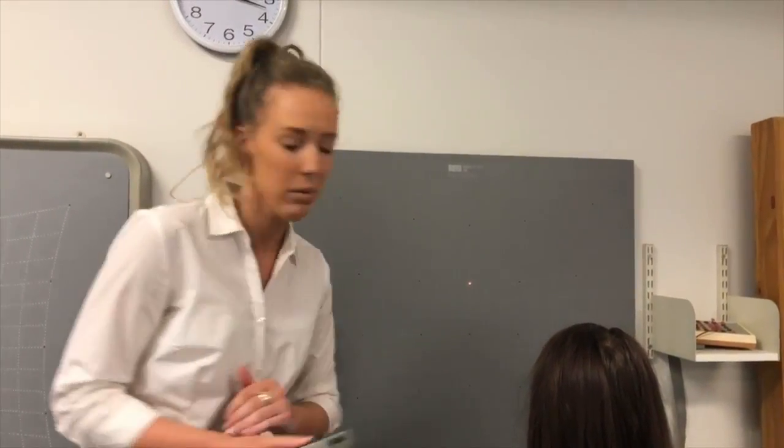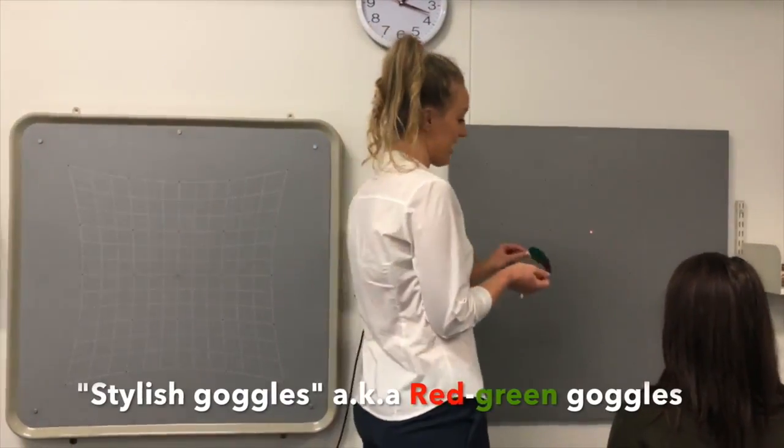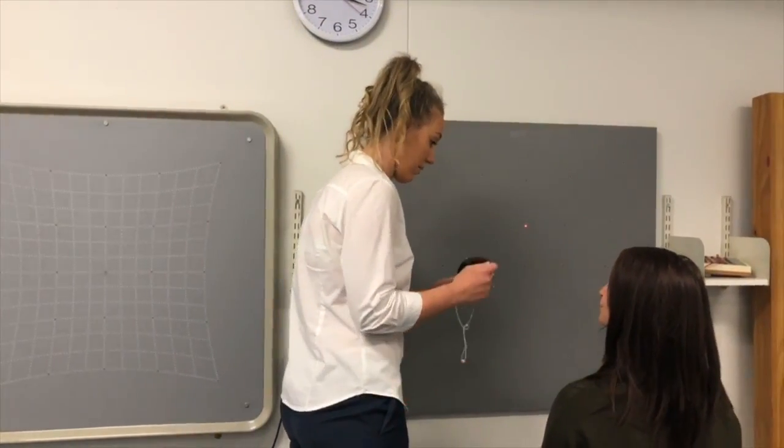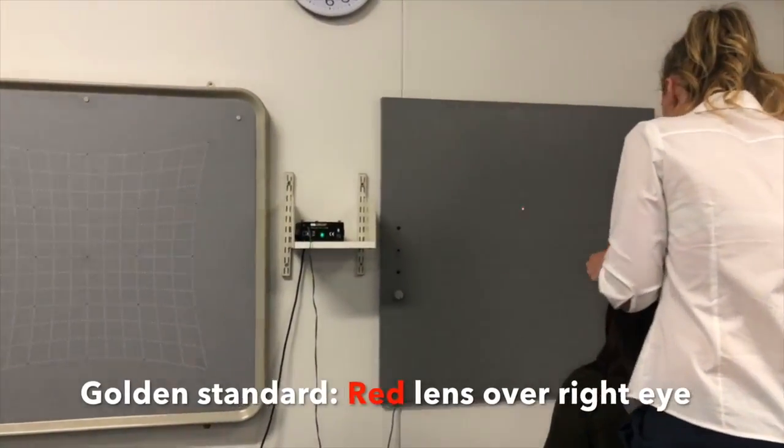Beautiful. Now what we're going to get you to do is we're going to get you to wear these really stylish goggles. Now, are you comfortable if I pop these on you now? We're going to make sure the right eye has the red goggle over it.